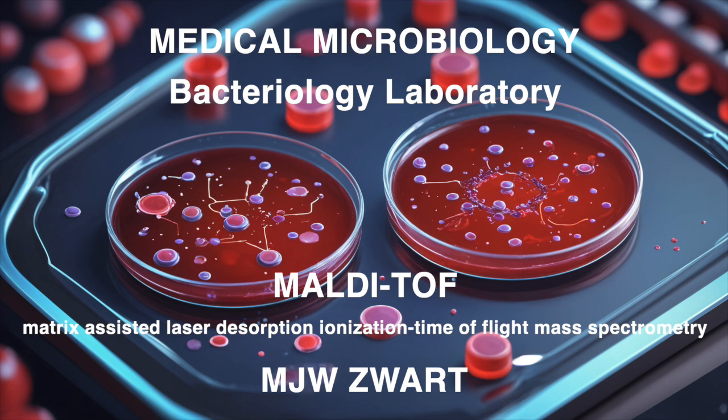Nope. Remember, the BTS contains specific E. coli proteins. They're like the reference point for the Microflex. Any changes to those proteins can mess up the whole validation process. So you prepare it, then you carefully aliquot it and store it at negative 20 degrees Celsius. Exactly. Got to keep it happy. It's amazing how even something as seemingly simple as pipetting can have an impact on the accuracy of the results. Yeah.